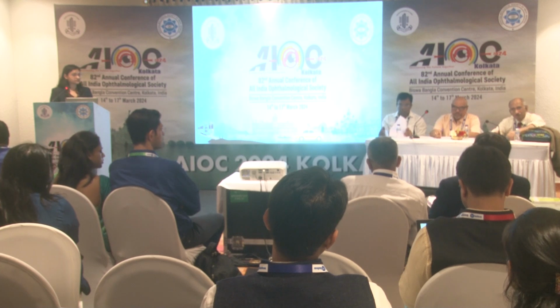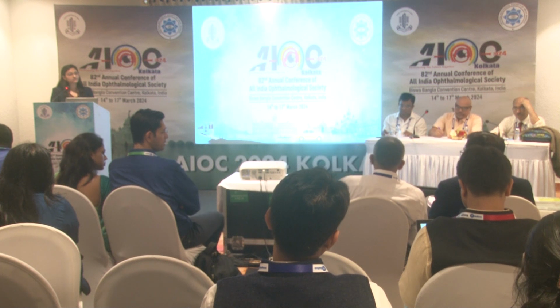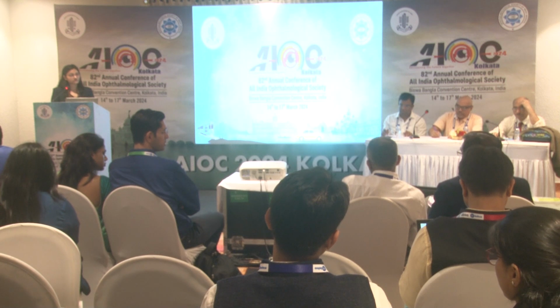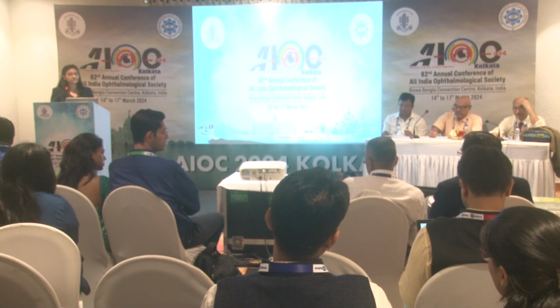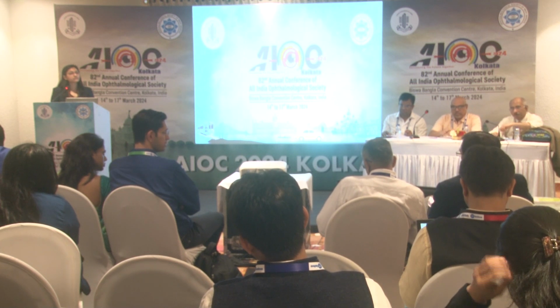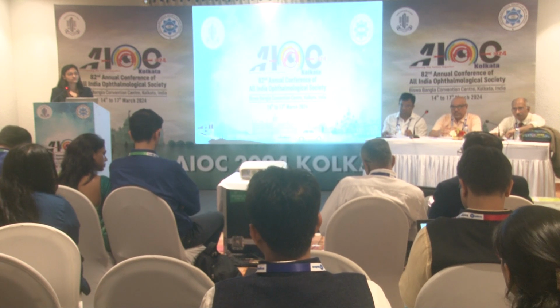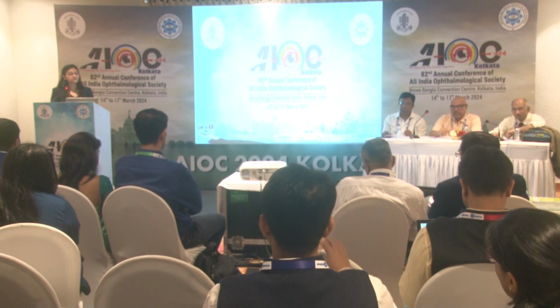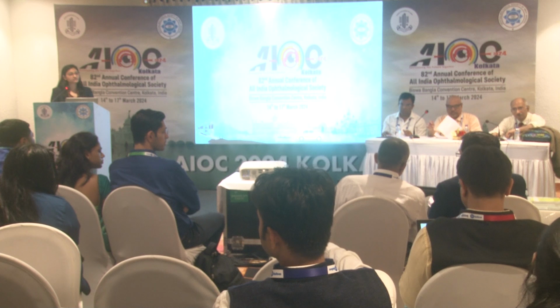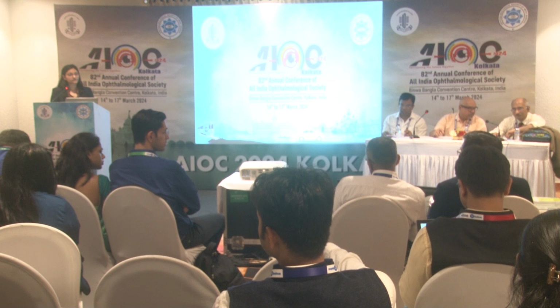I think so many injections are being given, so it's important to know what you have brought out for everybody is that intraocular pressure needs to be monitored. And I think what Paritosh said, that measuring the intraocular pressure is important to do in a sterile manner. So each of us develops our own technique of doing it. I do it with a 30 gauge needle. With the same needle, I just touch over the cornea and see how much bending occurs, and that way it gives me a gauge of how much pressure is there.